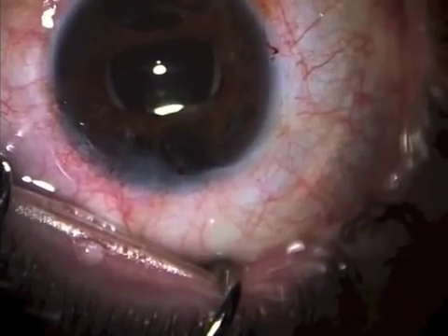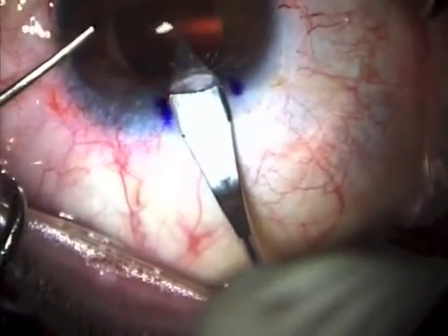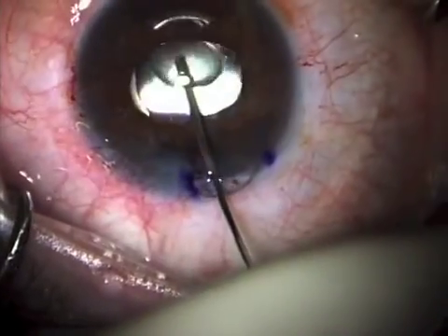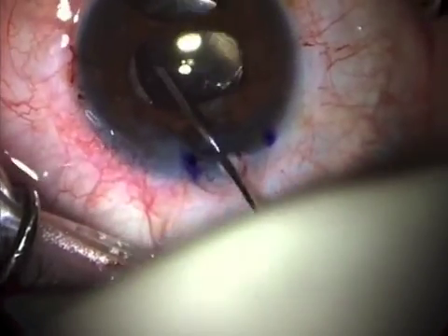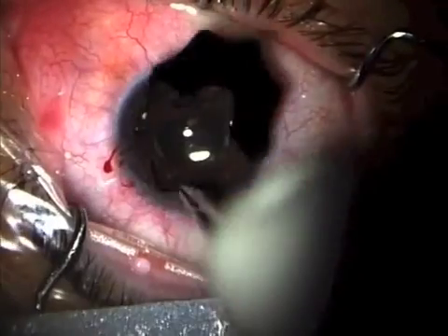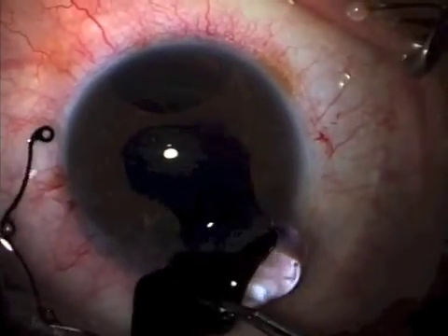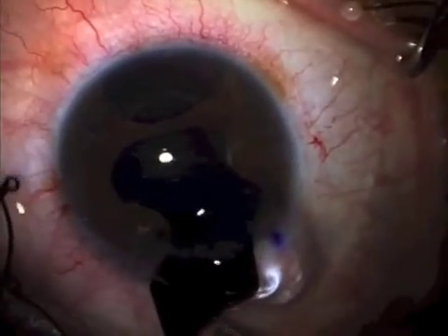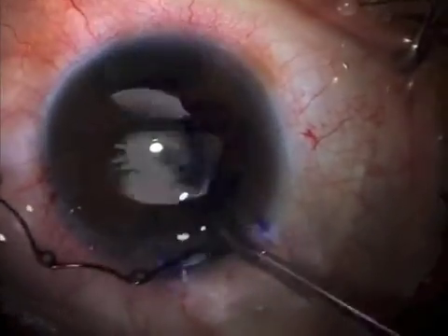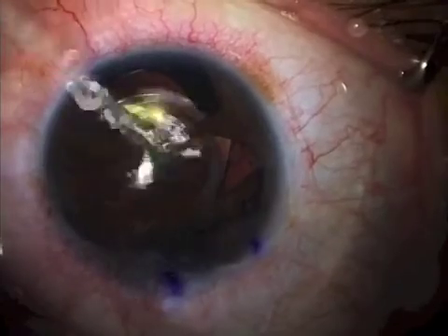We performed a 4.5 mm clear cornea temporal superior incision. We injected cohesive viscoelastic under the iris to create the space to implant the ring. With the help of thin forceps and a Synechialysis lens manipulating hook, we introduced the aniridia ring behind the iris.